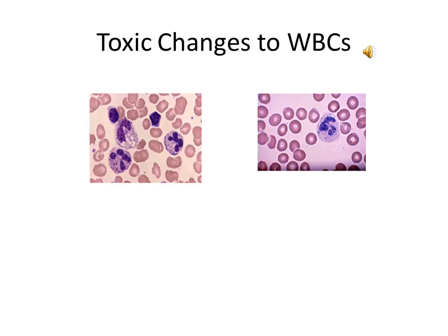In these two pictures, we're looking at toxic changes to white blood cells. Toxic changes occur due to severe infections, inflammatory conditions, or other leukemoid reactions. On the left, we can see the vacuoles. They look like the bubbles in one of the cells over there. It looks like a band. It's that group of 3, and it's in the middle of that group of 3. You can see the vacuoles there. All 3 of the neutrophils look like they have toxic granulation. And those are the medium to large granules that are evenly scattered throughout the cytoplasm. And toxic granulation occurs in these segmented neutrophils.